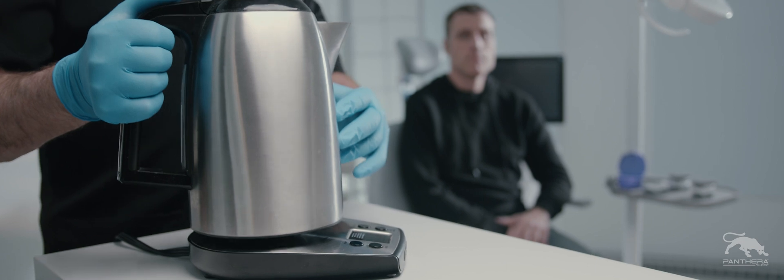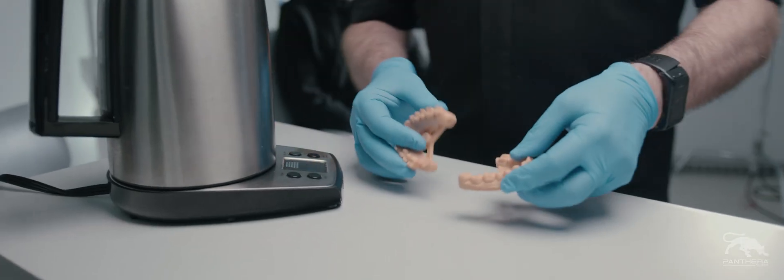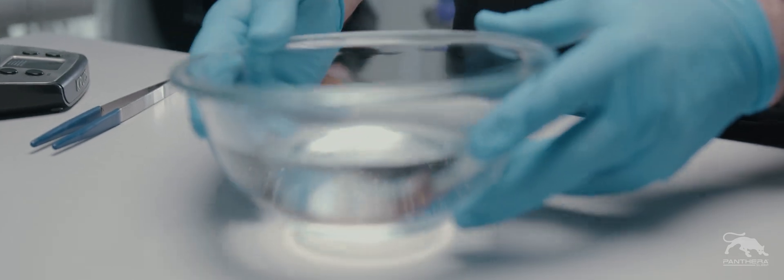To adjust retention, you will need a digitally controlled kettle, the patient's dental model as a reference, pliers with rubber tips, a timer and cold water.